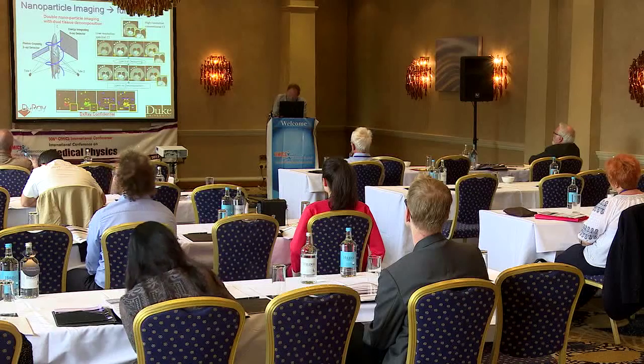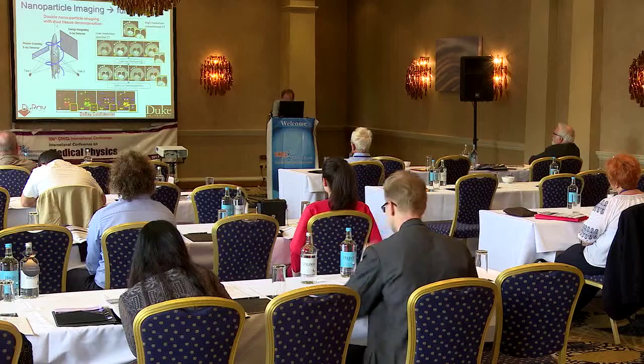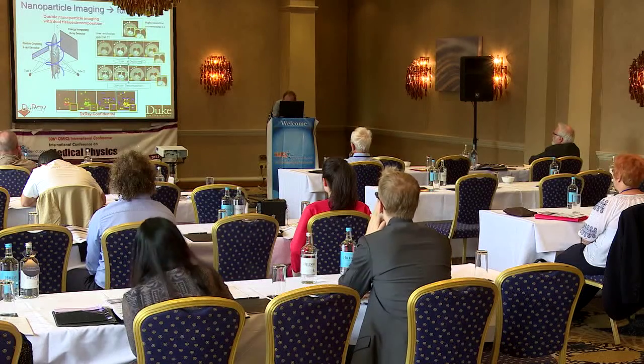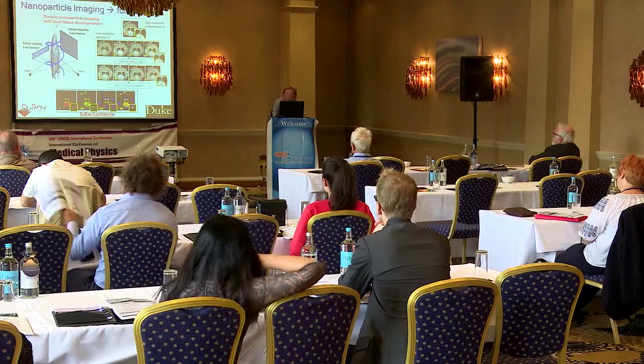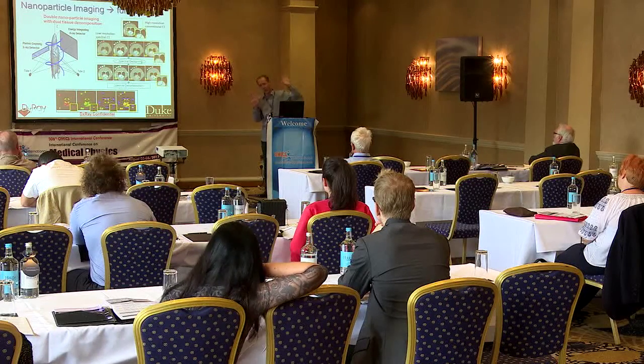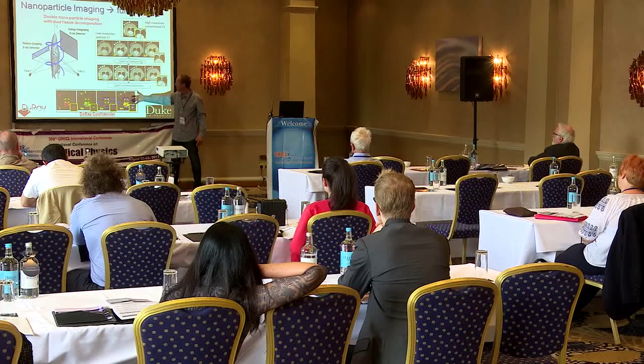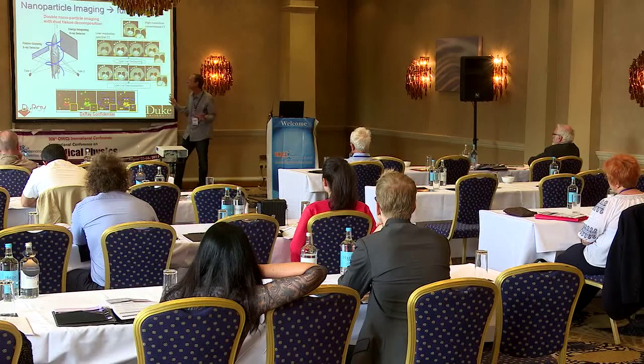And so here you can see some results of this imaging. We have iodine, gold, calcium, and all images put together, because once we have made the separate images, we can false color that image and then superimpose the images on top of each other. So we can now produce color images where the different nanoparticles or different tissue types can be presented all at once.